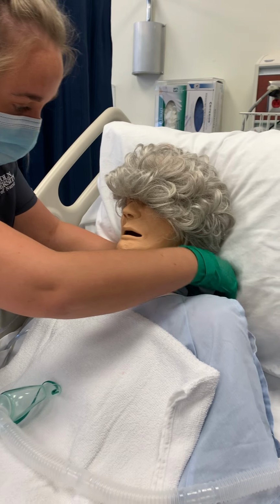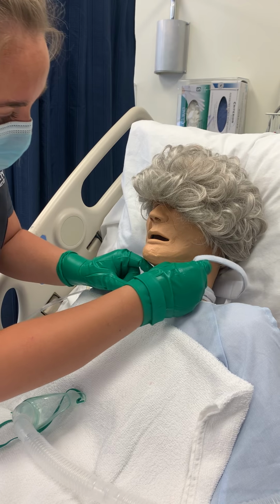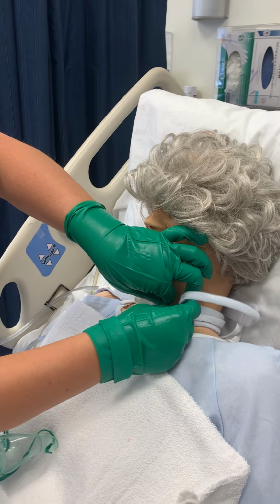I'm gonna reach behind you, sorry. Have to reach in front of your face, sorry, Mrs. Smith.